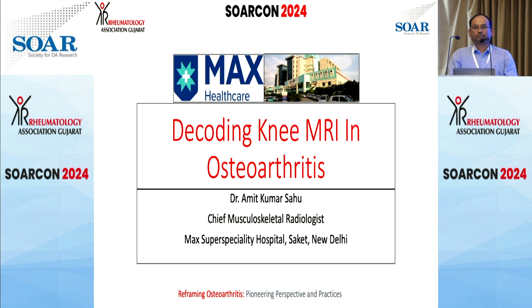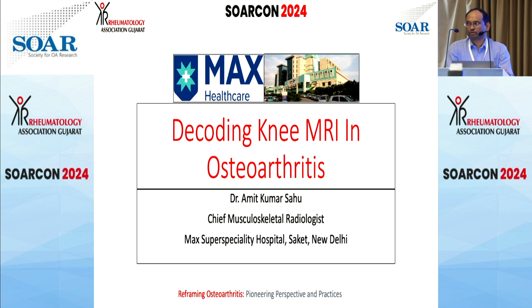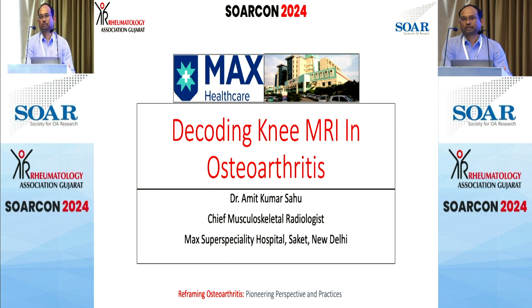In the next 30 minutes or so, for the first 5-7 minutes, I will be talking about how a normal knee MRI looks, and then what the specific and non-specific signs of osteoarthritis in the knee joint are. Then there will be an interesting interaction based on case-based discussion, where each case will be a lesson on why MRI is needed in osteoarthritis.